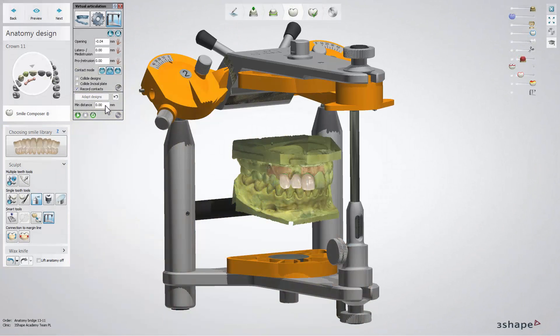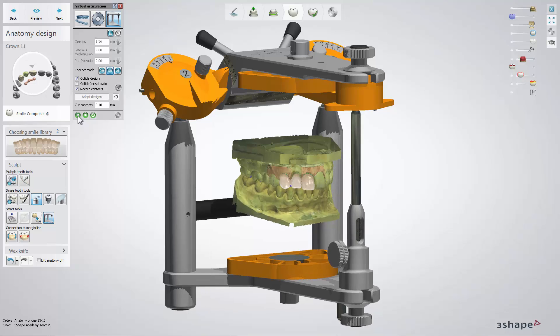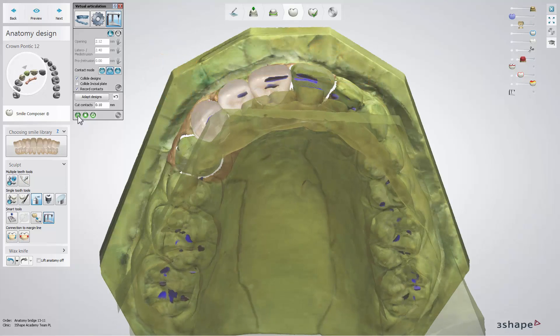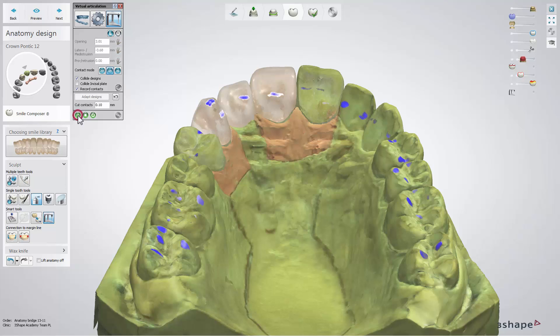When you design anterior teeth, the Collide Design option may be useful in cases where you don't wish to avoid contact altogether, for the reason of achieving anterior guidance and better function. For contact examination during different jaw movements, use the occlusal compass. The colors represent the occlusal compass movements.